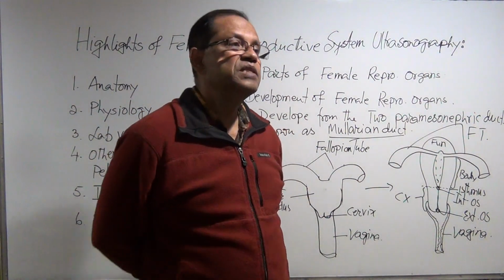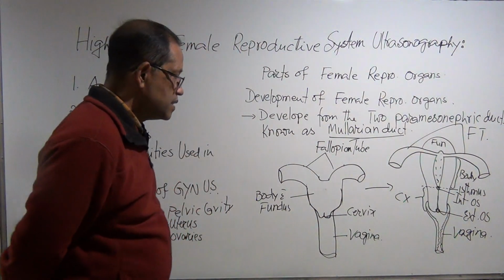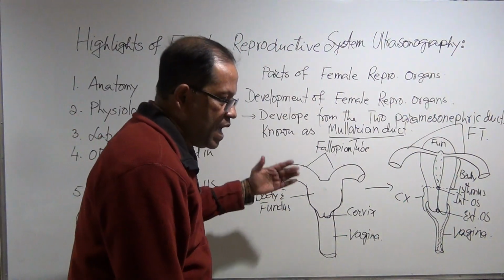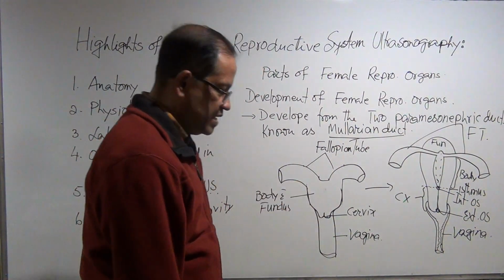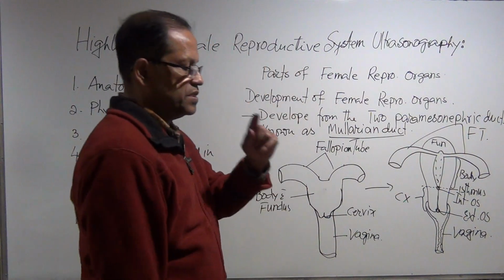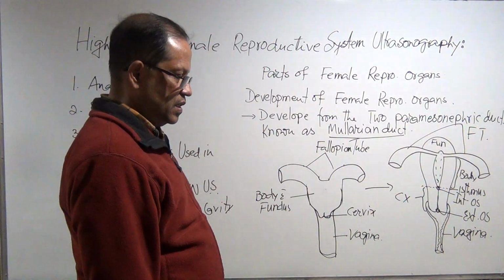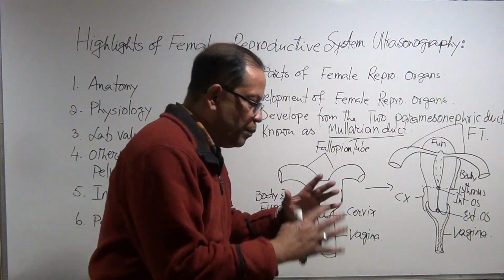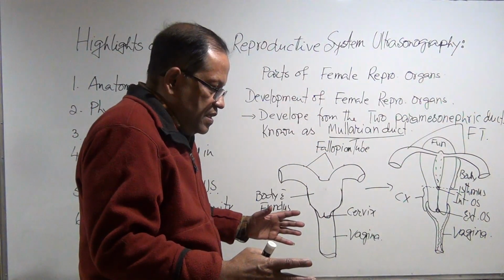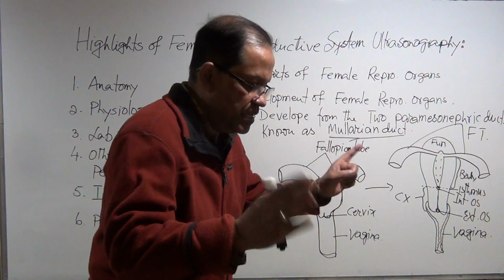Okay, so this is a very important thought. If you see something abnormal in the pelvic cavity, do I need to check the kidney? Yes. If I don't see a complete healthy uterus, do I need to check the kidney? Yes.